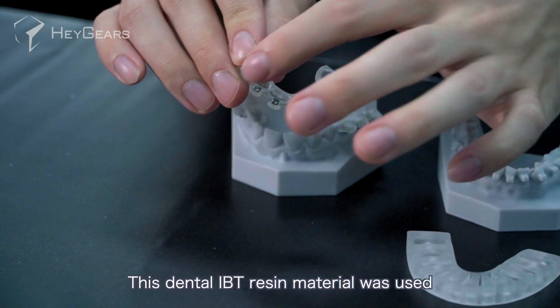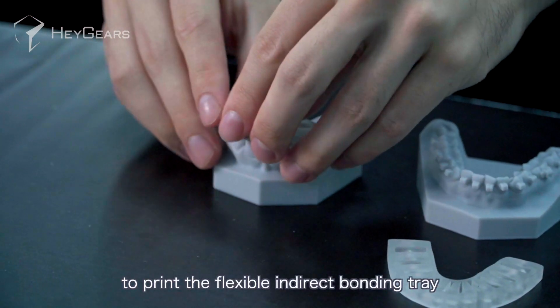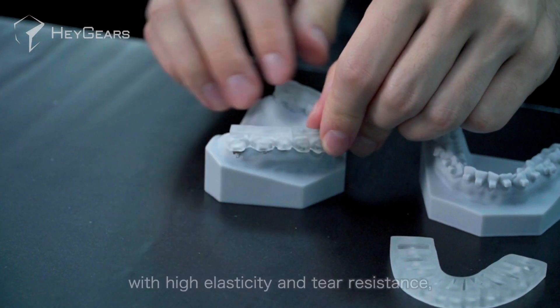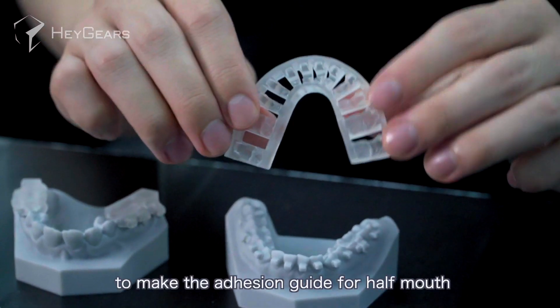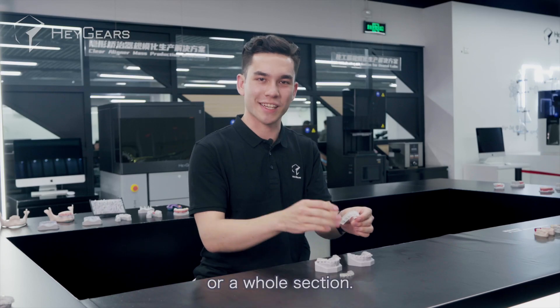This dental IBT resin material was used to print the flexible indirect bonding tray with high elasticity and tear resistance, which can be used to make the adhesion guide for half mouth or a whole section.